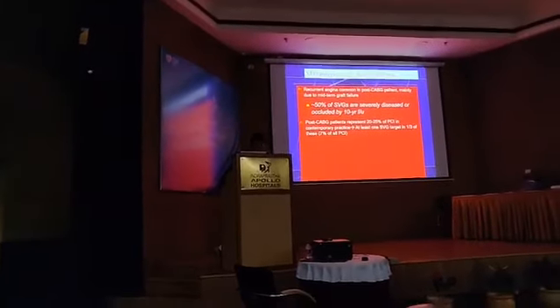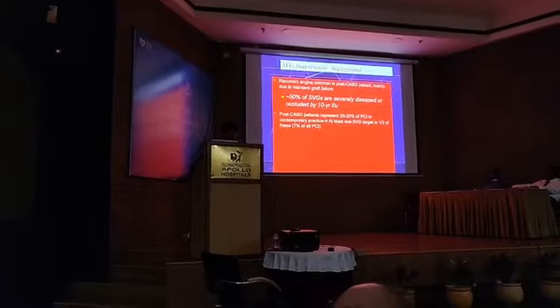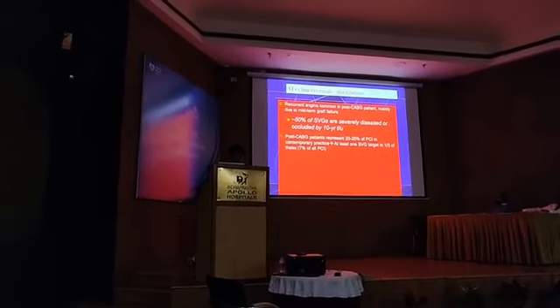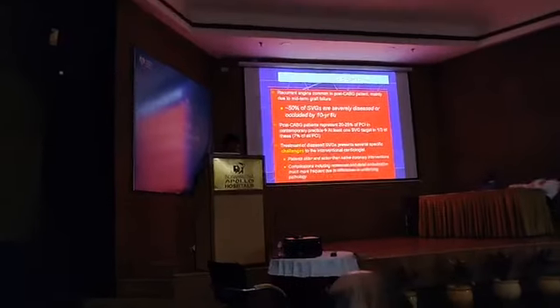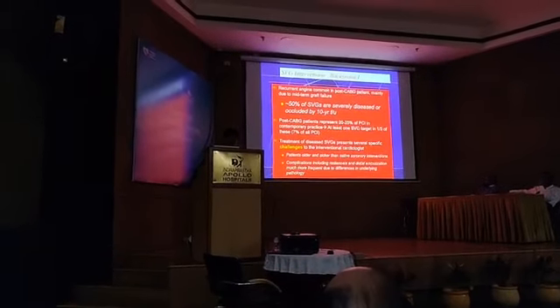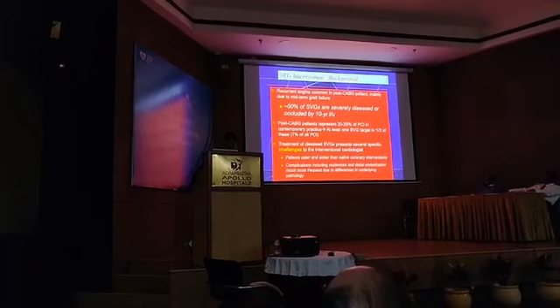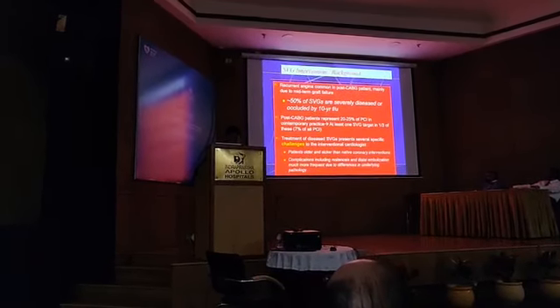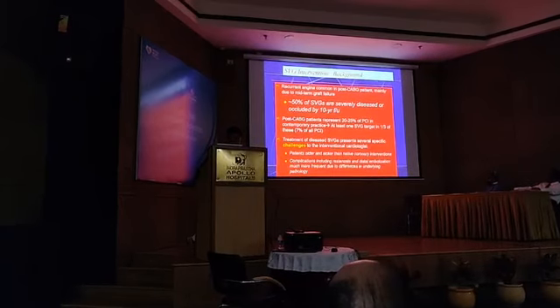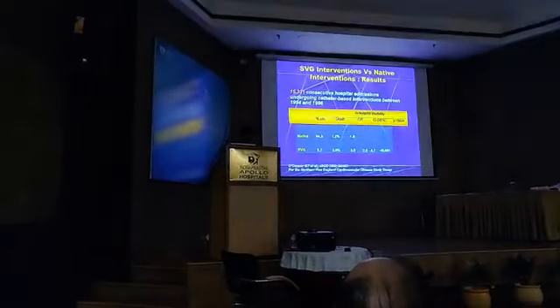Post-bypass patients represent 20 to 25% of PCI in contemporary practice. At least one saphenous vein graft is involved in one third of these, and 7% of all PCI are saphenous vein graft interventions in a busy center. Treatment of diseased saphenous vein grafts presents several specific challenges to the interventional cardiologist. Patients are basically older and sicker than in native coronary interventions. Complications including restenosis and distal embolization are much more frequent due to differences in the underlying pathology.